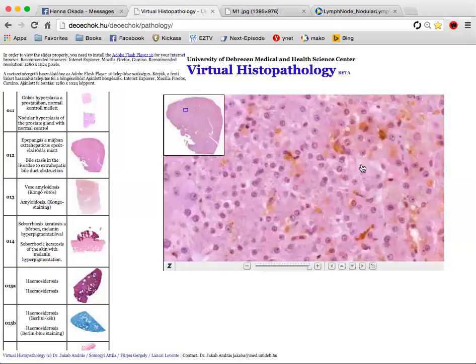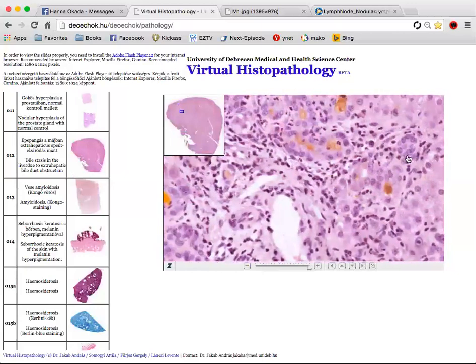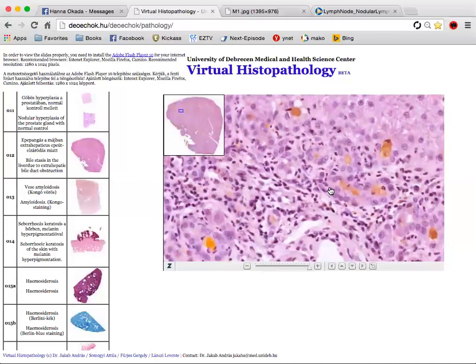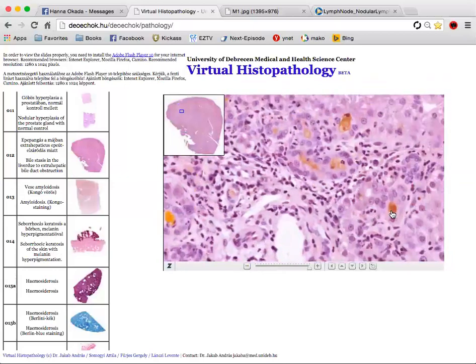And I just want to show you, in the larger bile ductules, you can see these. These are called bile plugs. That's just a lot of bile that plugs the ductule or the duct. And the way the person is going to look when you see him is jaundiced. Jaundiced. Okay.